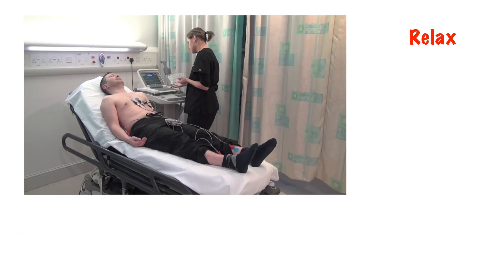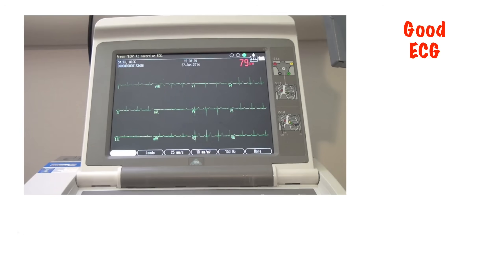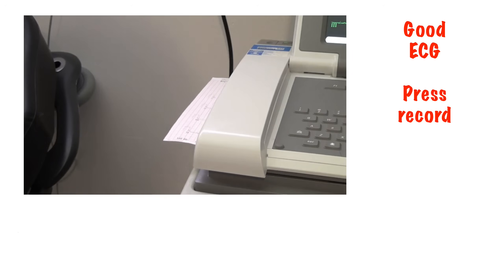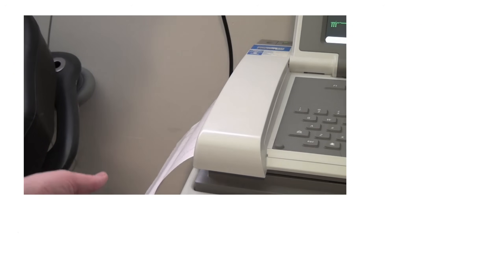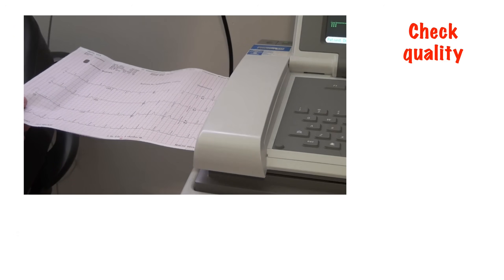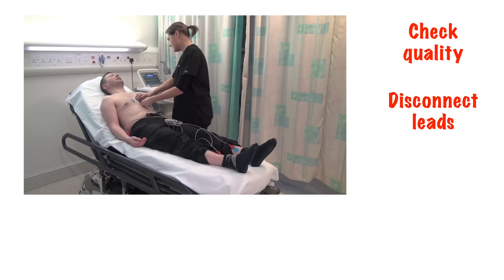Ask the patient to relax and breathe normally and not to move around. Check that you have a clear recording on the screen for all your leads and then press the ECG record button. All machines will vary a little, so make sure you're familiar with the one you're using. Check the quality of the printout and, if you're happy, disconnect the leads from the patient. If you're not happy, then repeat the recording until you are.